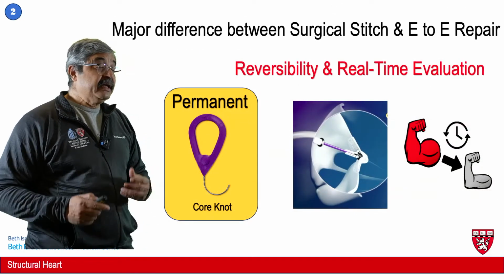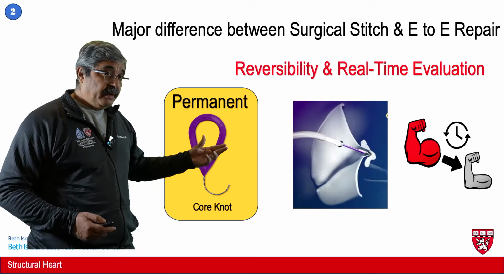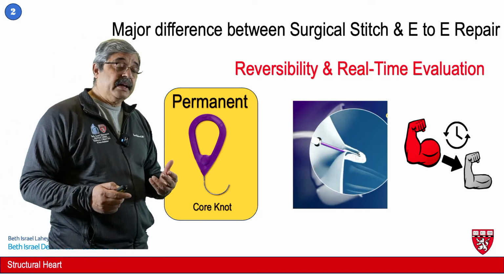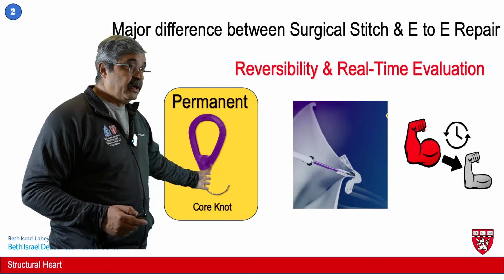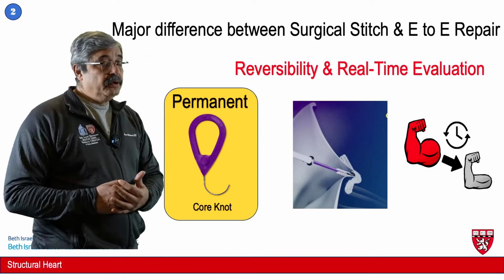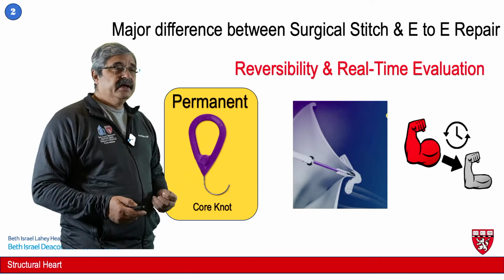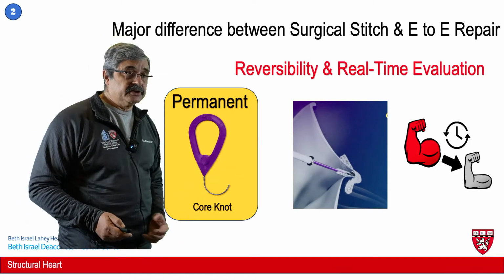The major difference between the surgical stitch, which was a very simple idea to go and stitch percutaneously, and the mitral clip device that was designed, was the ability to reverse until you get deployed completely and to assess the result of the application in real time using transesophageal echo. So that was the major difference between a surgical stitch applied percutaneously, which is a very easy process to do, and mitral clip, which was a much more complicated device, but it could be retrieved and redeployed. The results could be assessed, and therefore in real time all these changes could be made, whereas a stitch was a one-and-done kind of situation.